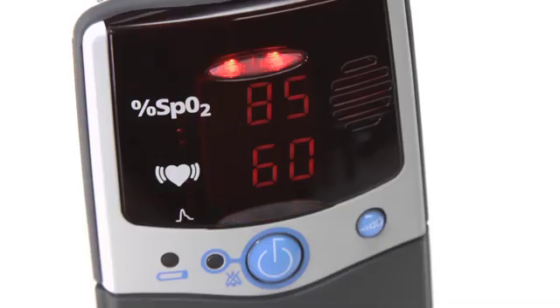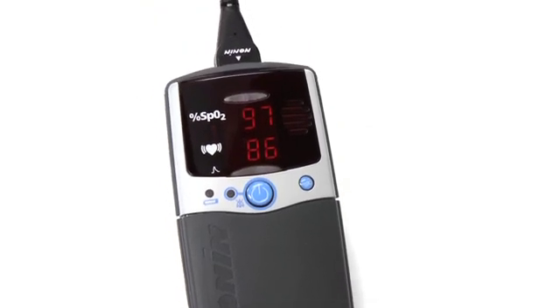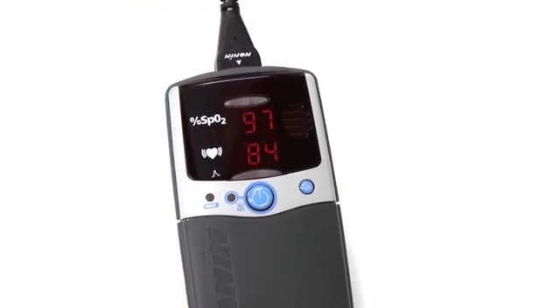The 2500 and 2500A models are identical, except the 2500A has the additional ability to program alarms that indicate when oxygen saturation or pulse rate fall outside of preset ranges.